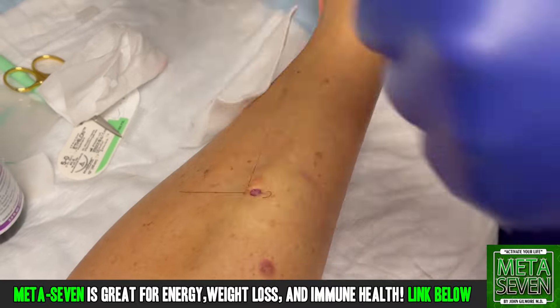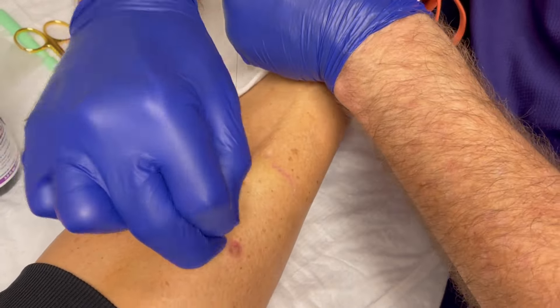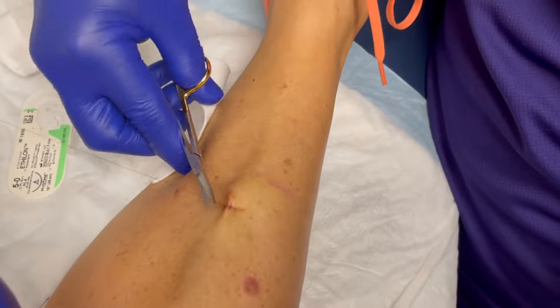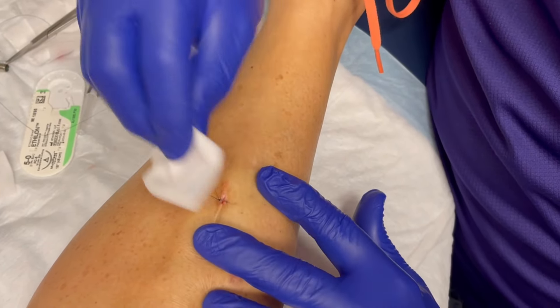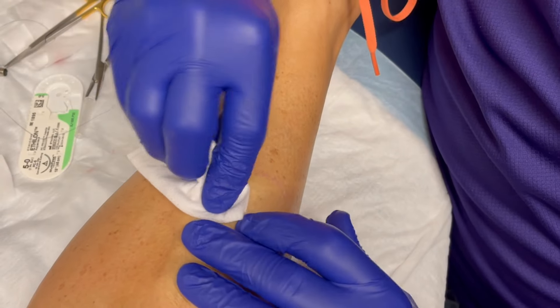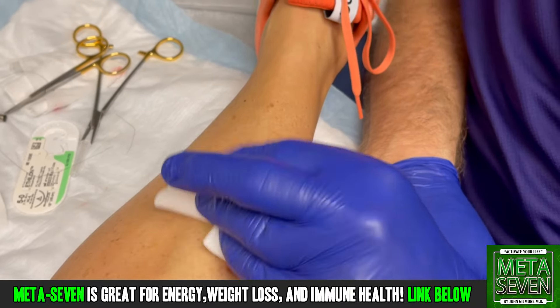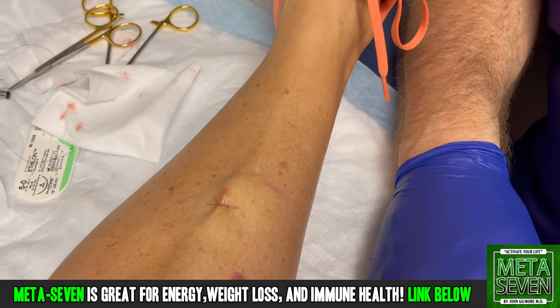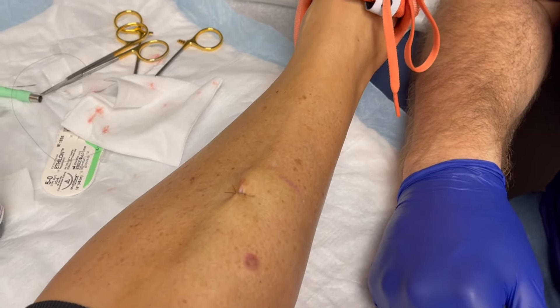After it's healed, you'll want to rub vitamin E and a little sunblock on it every day for about a year. You have to be careful here — with thin skin that can actually tear through if you're not careful. We just lay it out like that, approximate the sides of the punch, and it'll heal great. Stitch comes out in five days — it'll feel like two but it's one. Thanks for letting us record your procedure.